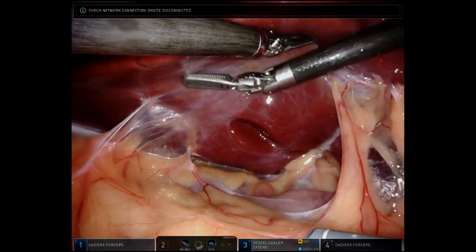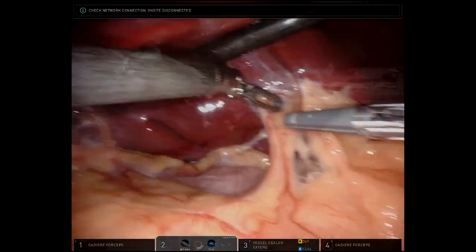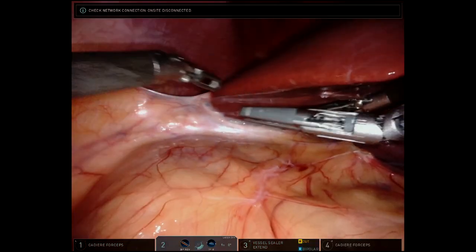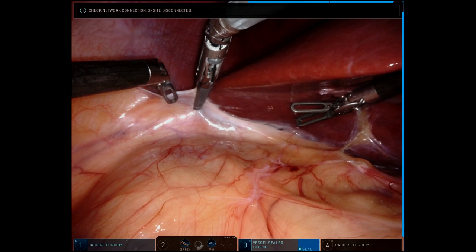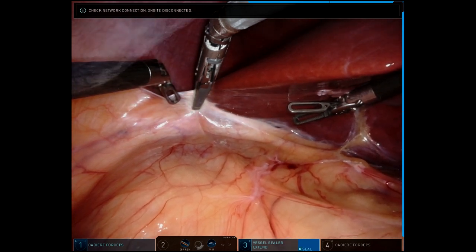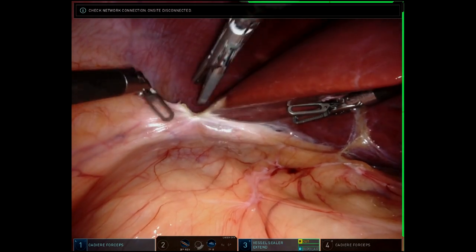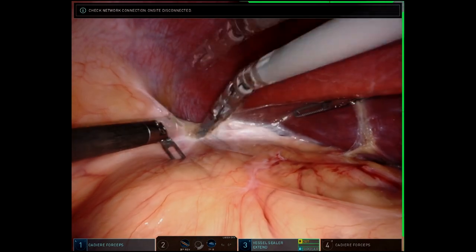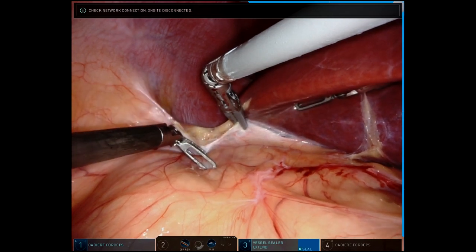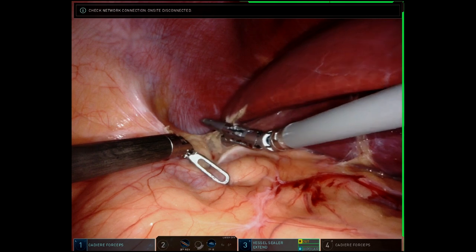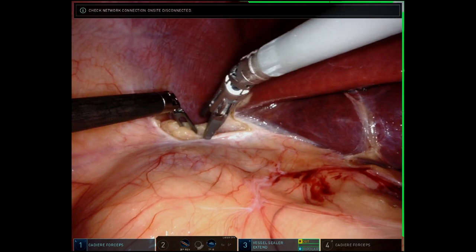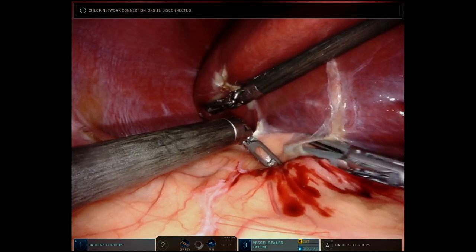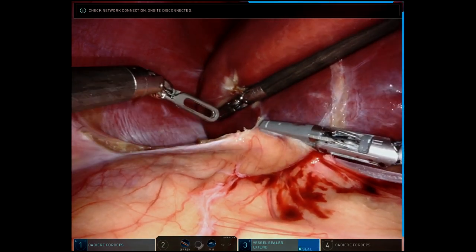The procedure has begun with mobilization of the liver. Adhesions from her previous cholecystectomy are divided. The right triangular ligament and retroperitoneal attachments of the liver are mobilized next. This dissection continues medially until the inferior vena cava is encountered. The wristed instruments ease this dissection. Once the liver is adequately mobilized, it is retracted cephalad with the fourth robotic arm, exposing the anterior surface of the adrenal gland. The fourth arm essentially replaces the need for an assistant to retract the liver. In obese patients, this is particularly useful as there is no struggle with assistant fatigue while retracting a heavy liver.